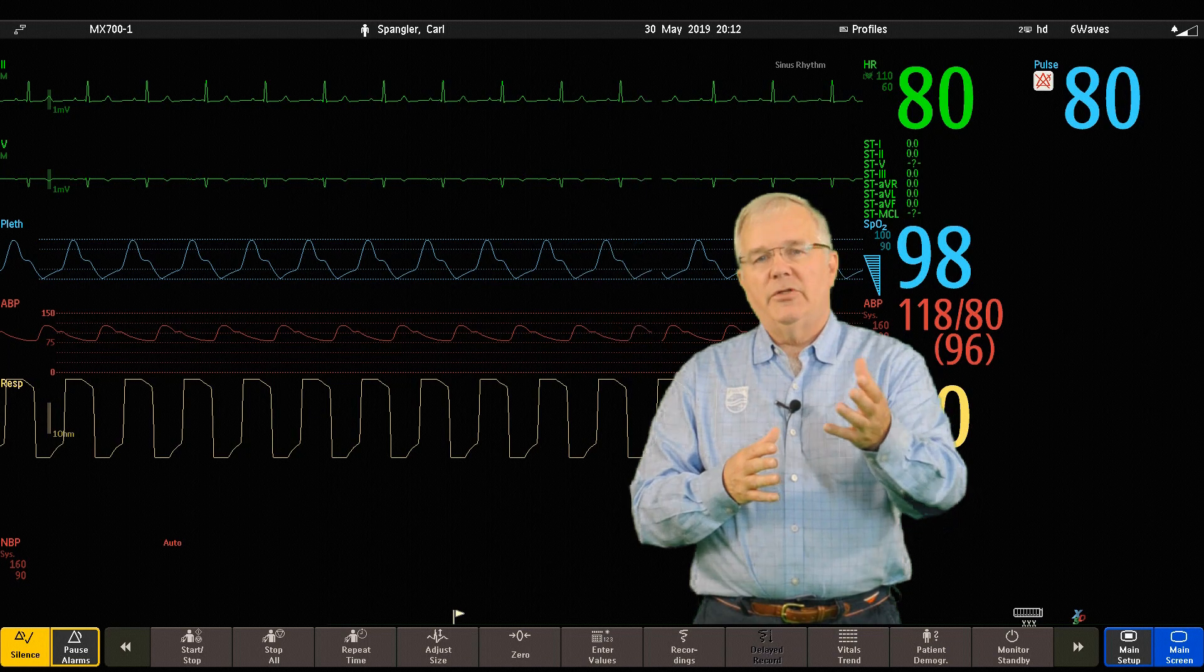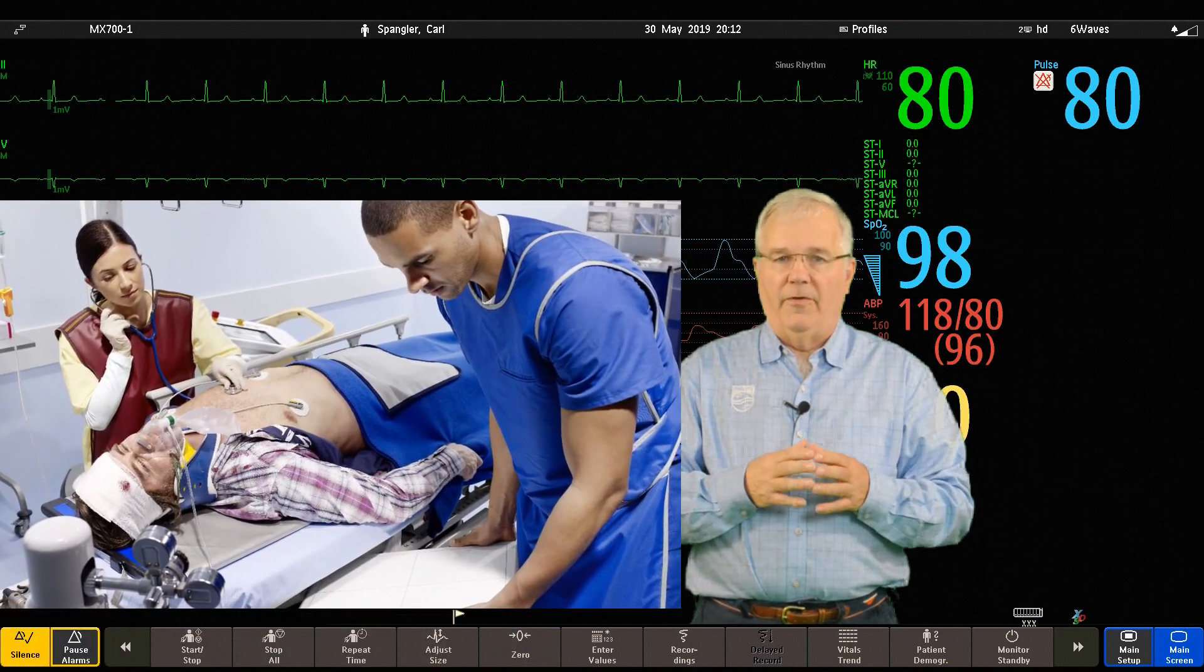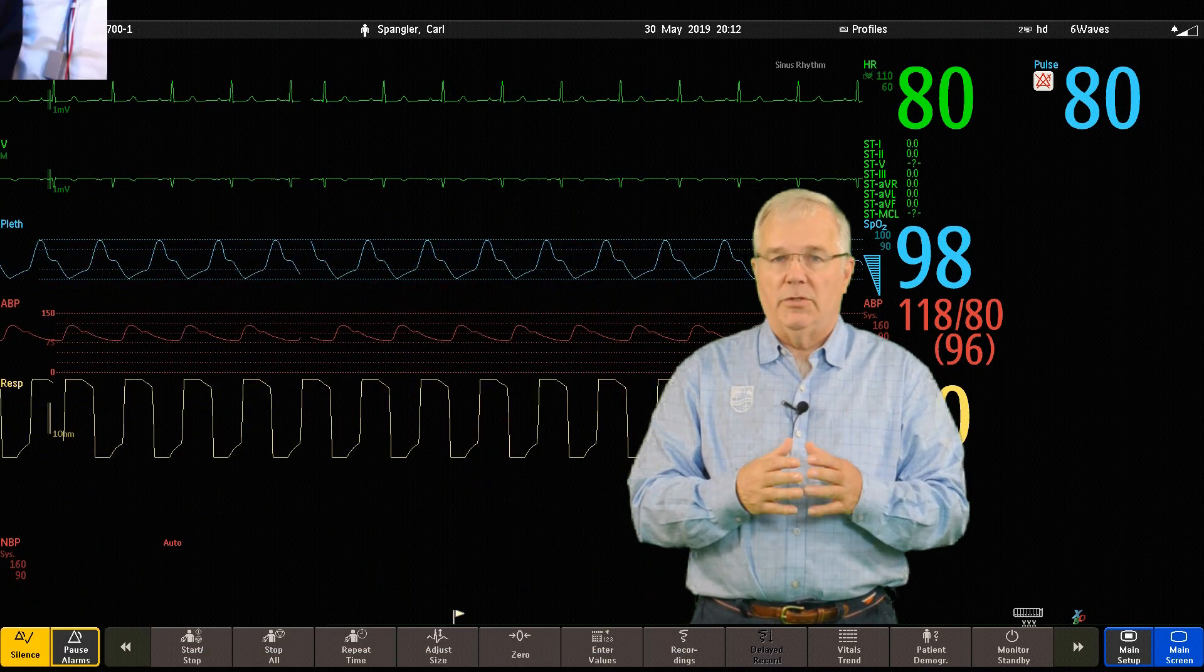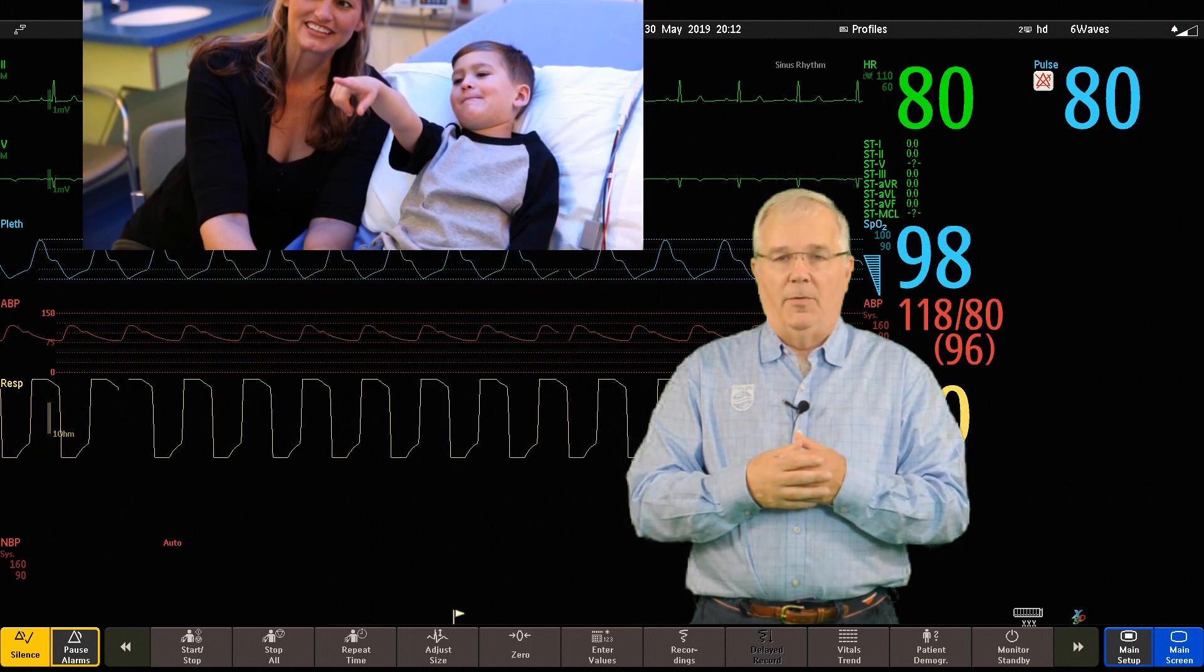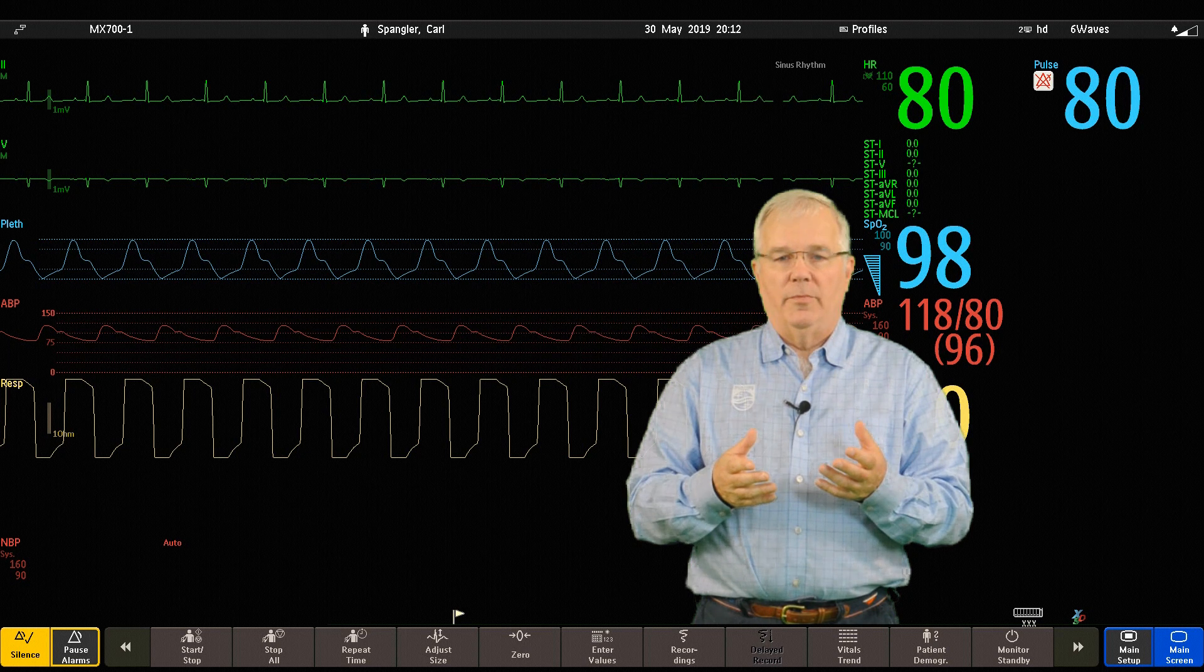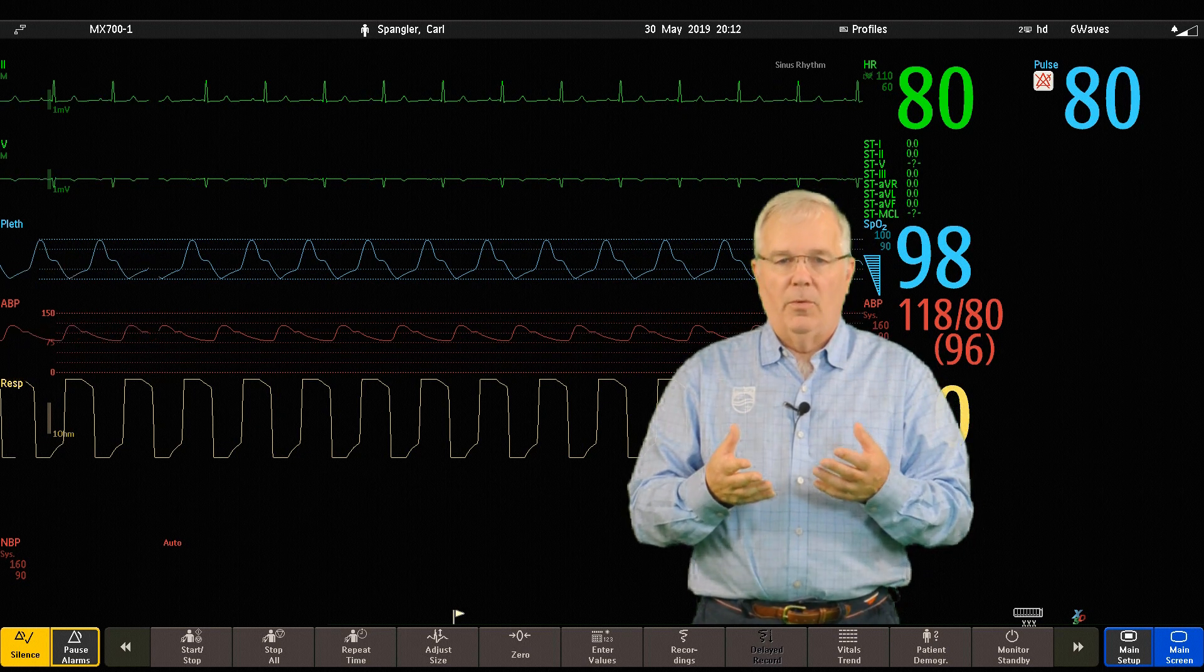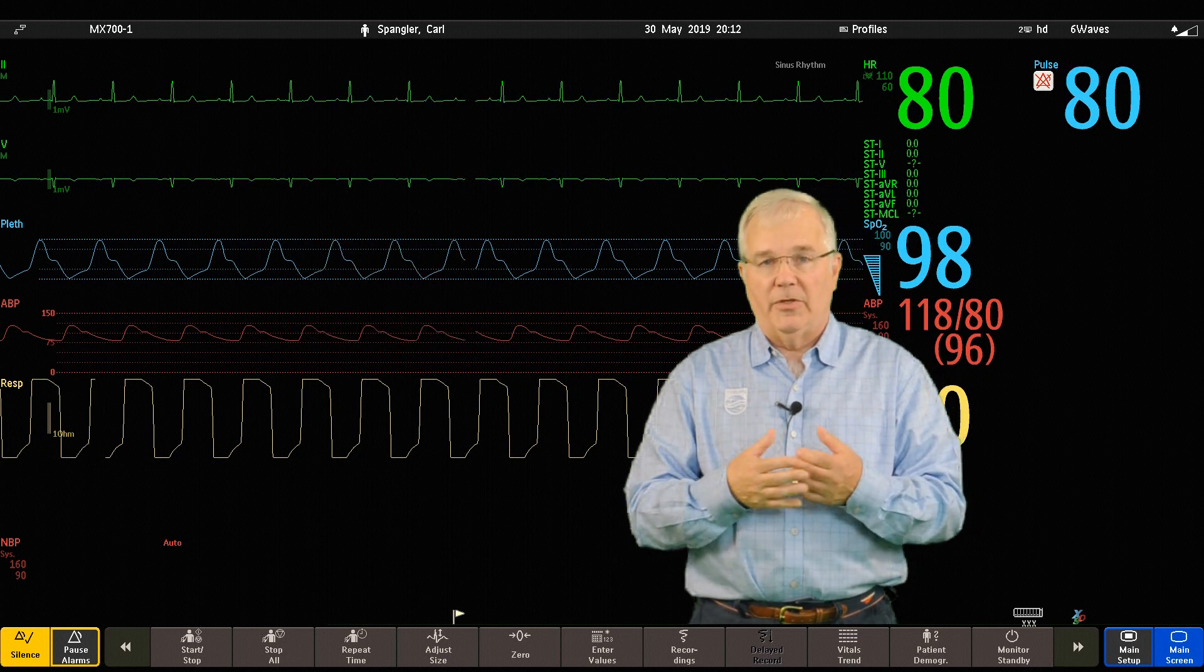So let's consider this example. You're in the emergency room and your monitor is currently configured for an adult patient. But your next patient is a 5 year old child. So by switching to a predefined pediatric emergency room profile, you can have appropriate measurement settings such as alarm limits and patient category with one touch instead of having to alter measurements and limits individually.